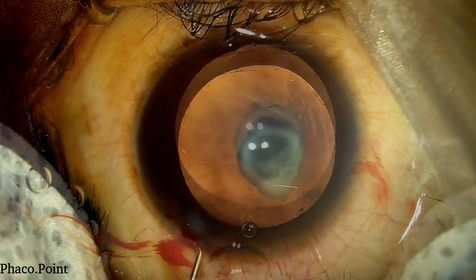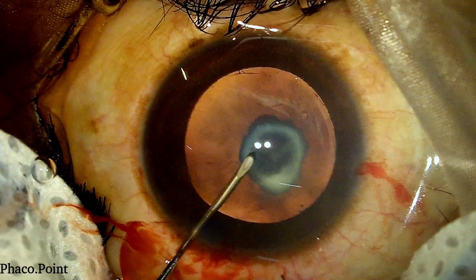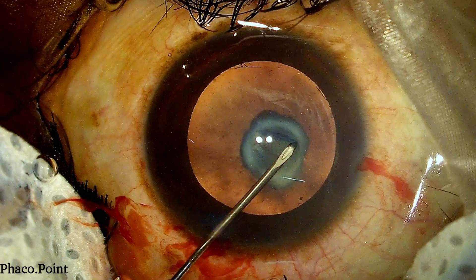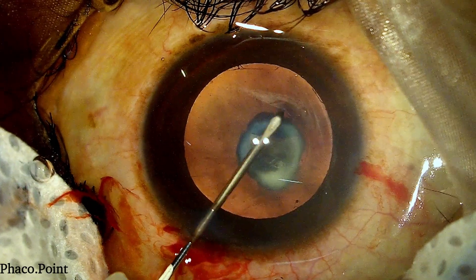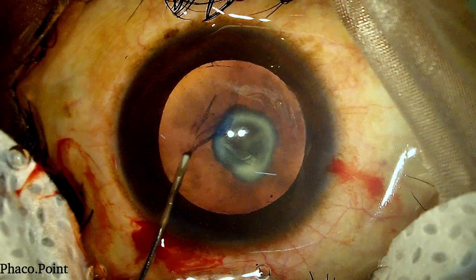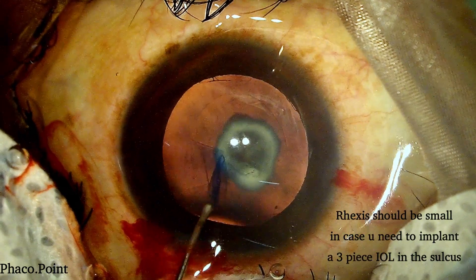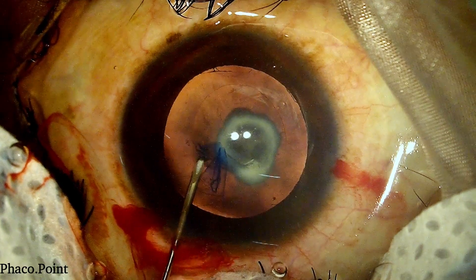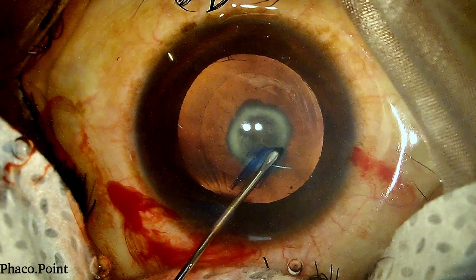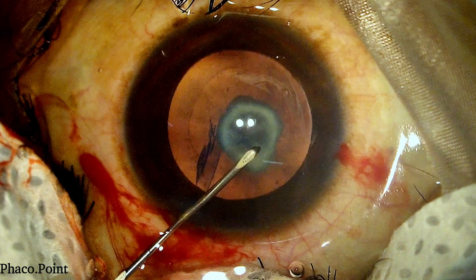All our movements during a phacoemulsification of a polar cataract need to be gentle. We then proceed with making the capsulorhexis. I like to do it with a good amount of stereo coaxial illumination, as you can see here, because it enhances my visibility. I also like to create a capsulorhexis no more than 5 mm in size. I ensure at this point that the patient doesn't make any jerky movements by instructing him to keep his eyes absolutely steady. We have now completed the capsulorhexis.